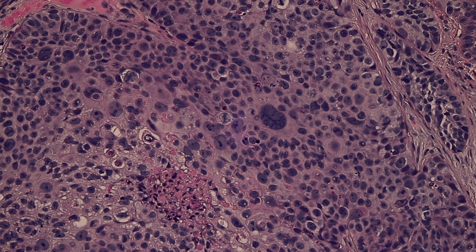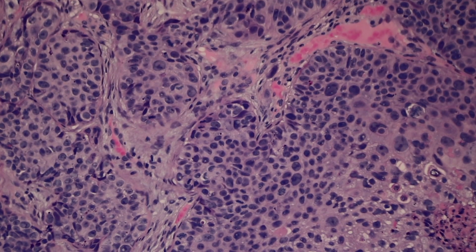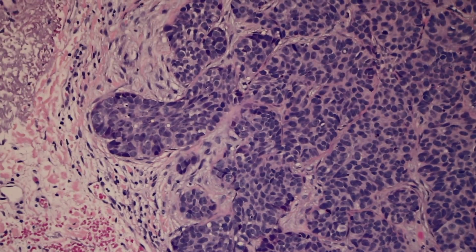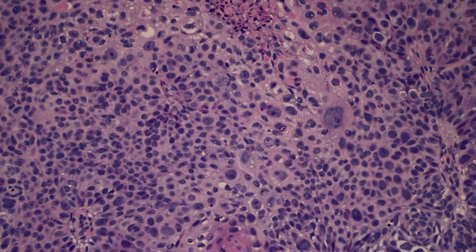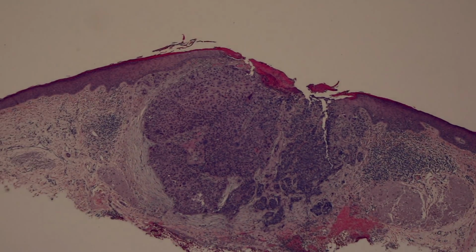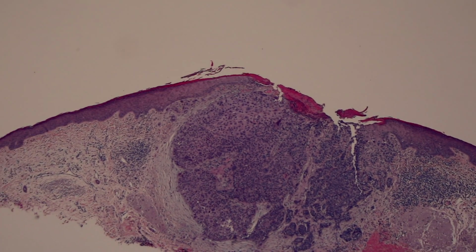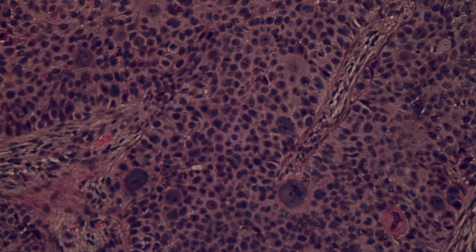But when I see really ugly cells and also see some keratin production or pink cytoplasm, sometimes you have to go a little closer to tell that, and then it depends on your H&E from lab to lab. Those things can help. But there's really dramatic pleomorphism in some of the cells in this squame right here. And again, look, it connects to the surface, but really the adjacent epidermis shows not much in the way of AK or squam in situ. Here's another look showing the really abundant atypia.